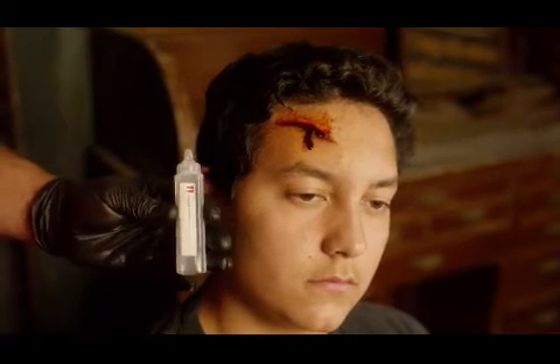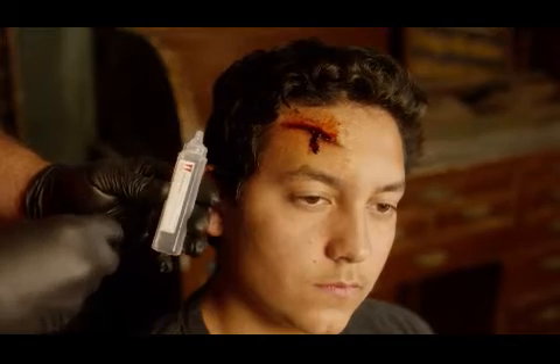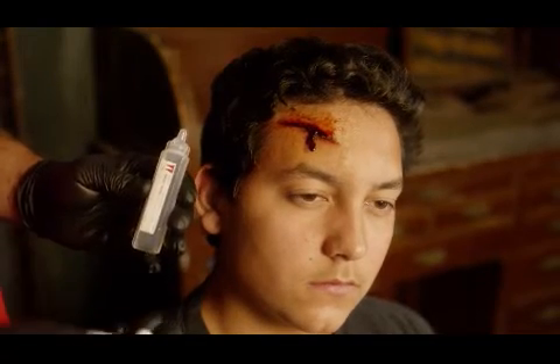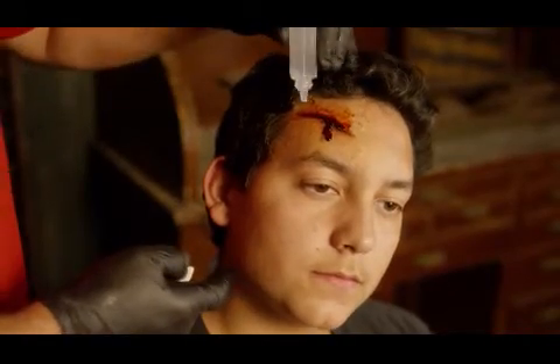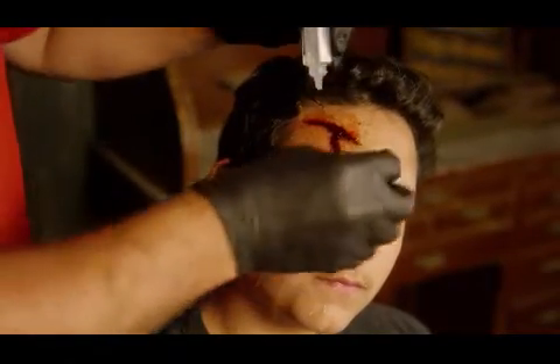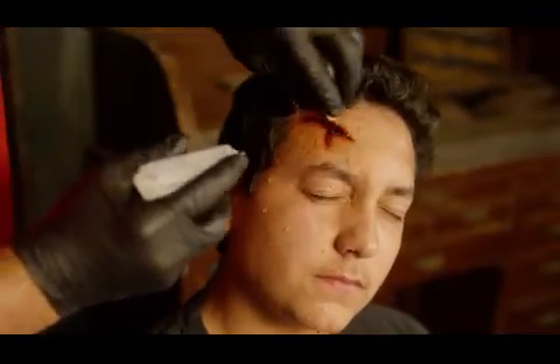For any laceration that I need to clean out, I can use my Salajet Wound Rinse. This is one ounce of sterile saline that gives me a good jet spray into the wound. You can see I can really spray in there and clean the wound.